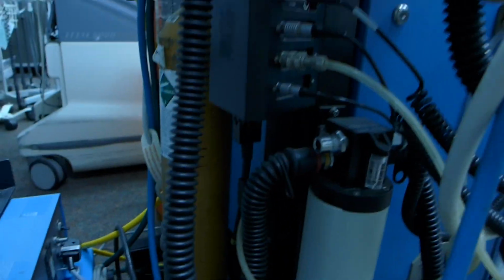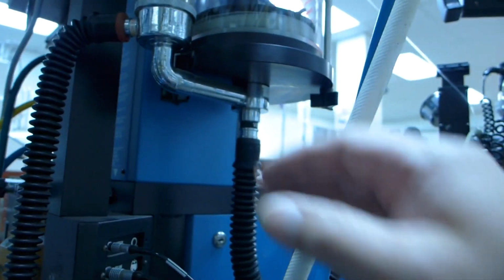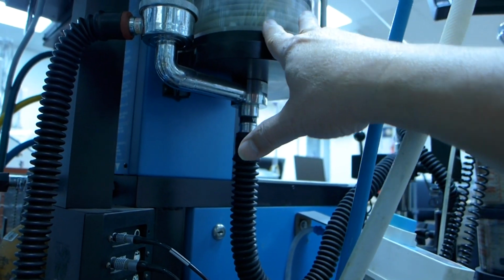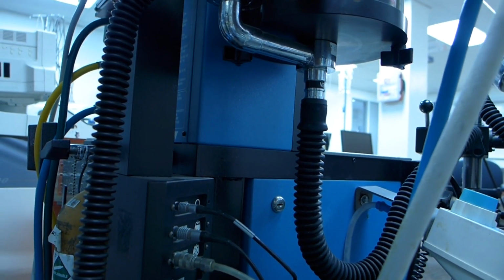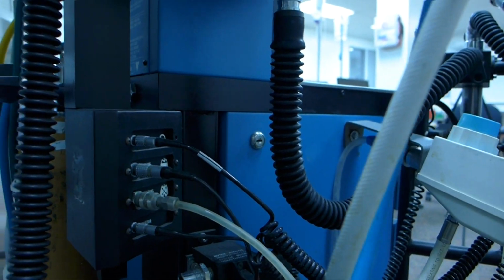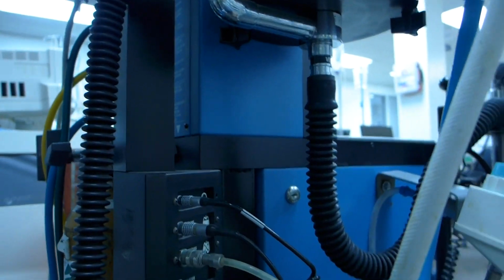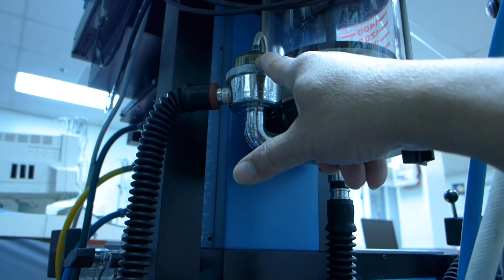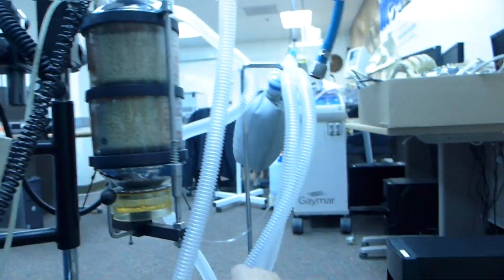Okay, as I discussed with you earlier, how the rebreathing circuit breathing system works, this has a little bit of air pressure that pushes back like a PEEP. So this device here creates about 2 centimeters of PEEP into the breathing circuit system here.